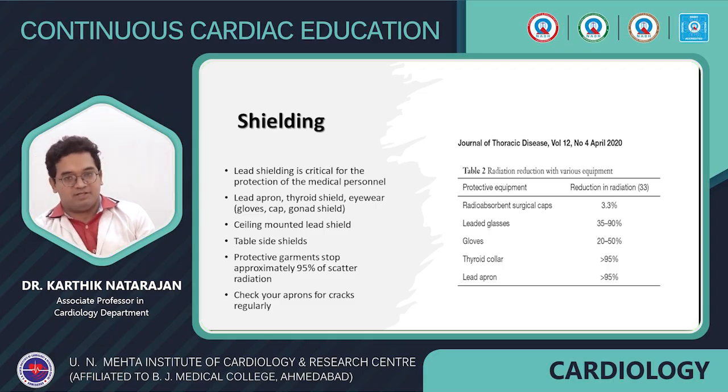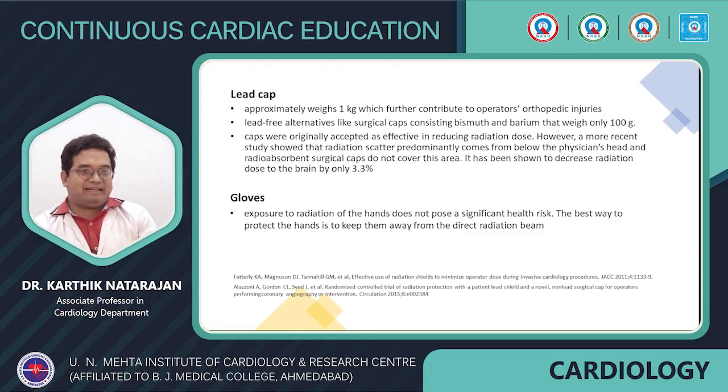Now, a lead cap, there are controversies regarding the use of a lead cap. Some of the studies have shown that it has been able to reduce the radiation dose only by 3.3%. What would be more useful is to wear a hood, which may actually cover more area and prevent further exposure.